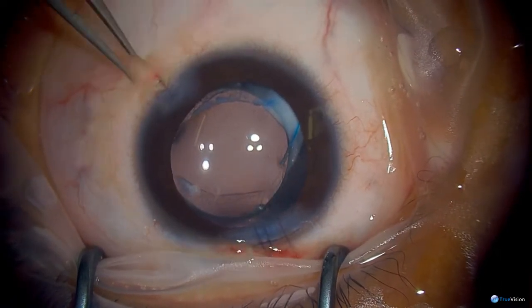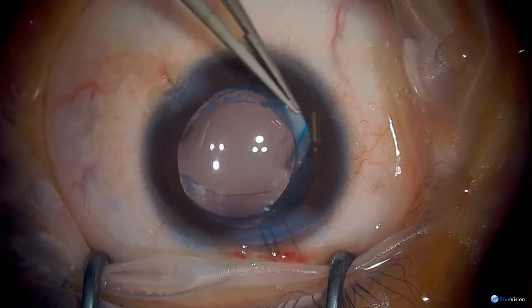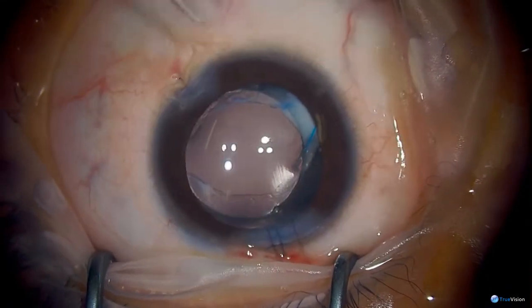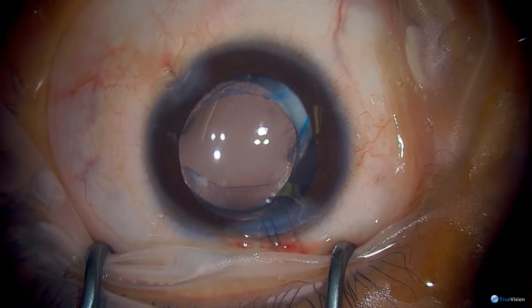So the lens is decentered slightly temporally, but I think that if we go in, the risk is ripping there and the lens might become unstable. So I'm really happy with that there. I'm happy with the lens in its current position. And centrally, it'll be well centered in the pupil.